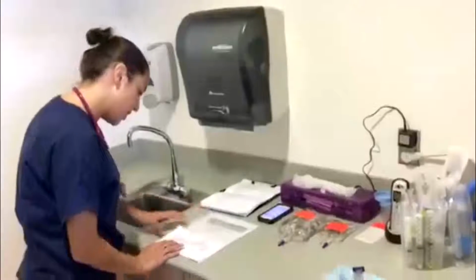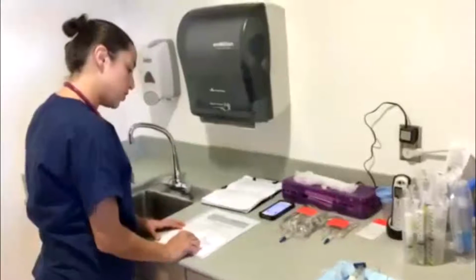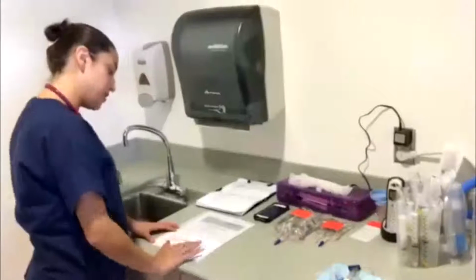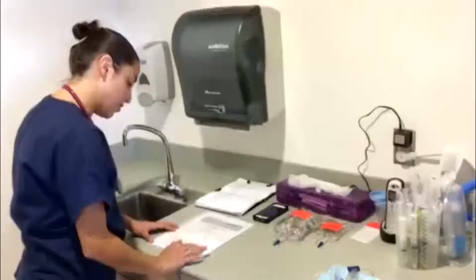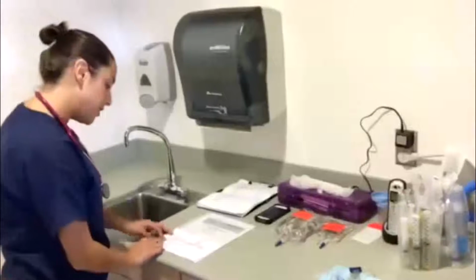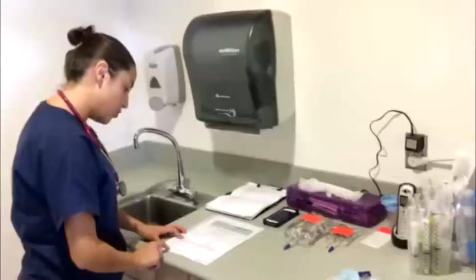Okay, so my patient is Mr. Sweetheart, who is a 72-year-old man who presented into the emergency department with shortness of breath, a productive cough with green sputum, and generalized weakness. Mr. Sweetheart has a history of hypertension, COPD, Parkinson's, and is allergic to shellfish and sulfa. His admitting diagnosis is pneumonia. So I have already taken his vitals, everything is stable. And as I said before, the physician ordered 2 IV fluids.